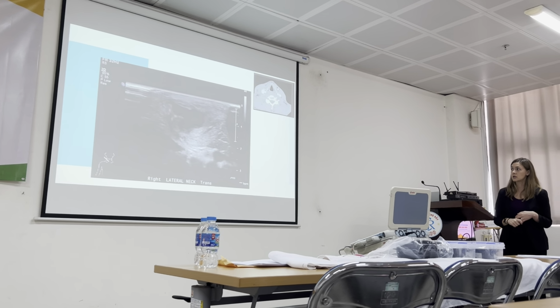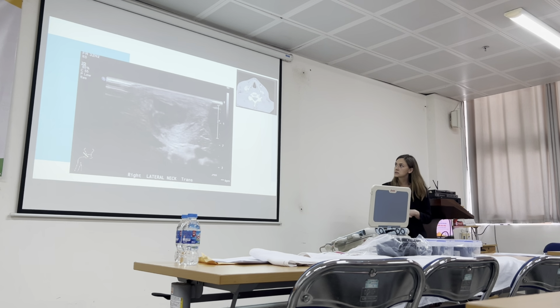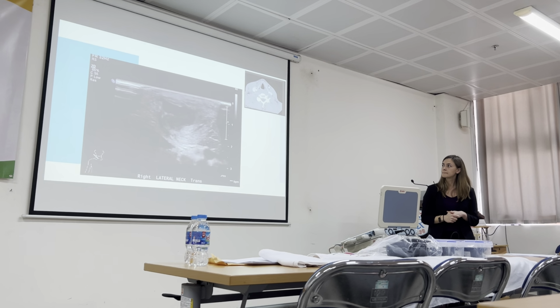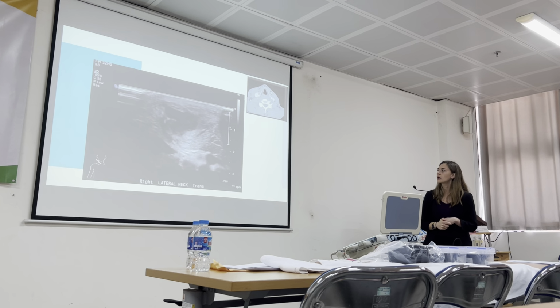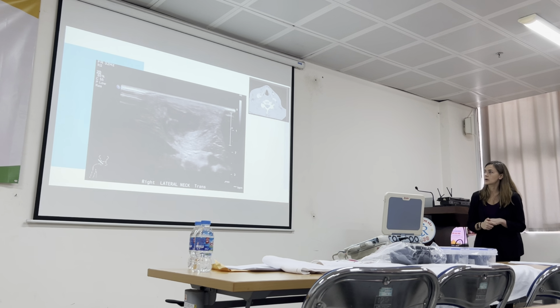It has a hilum going in, okay. Here, we think that might be a hilum, okay. What else? This one's tricky. Behind it, there's no white. Okay, good.